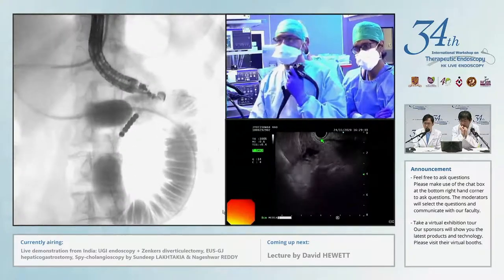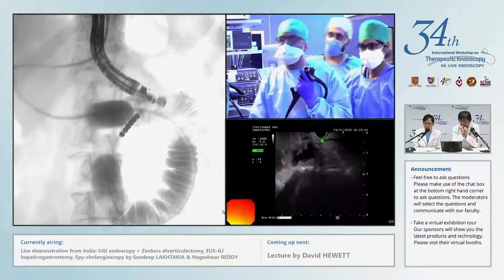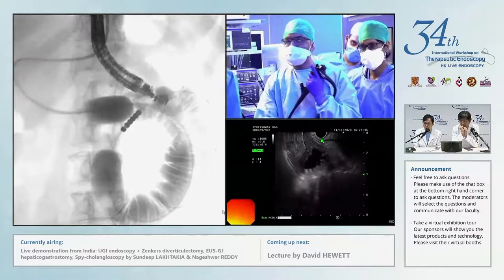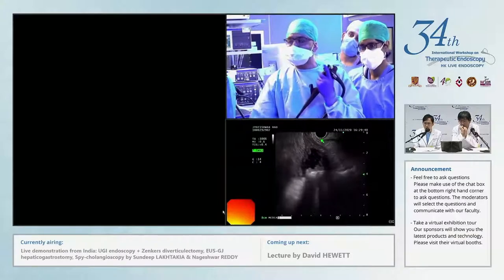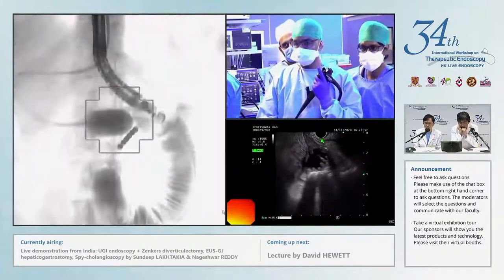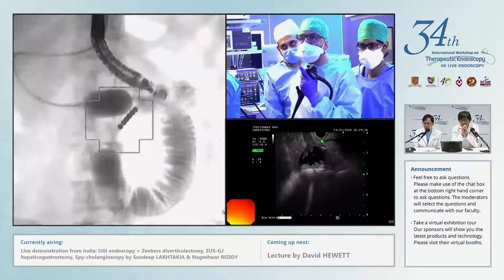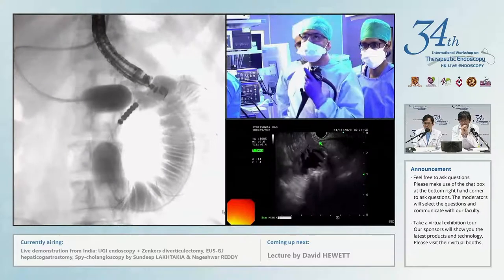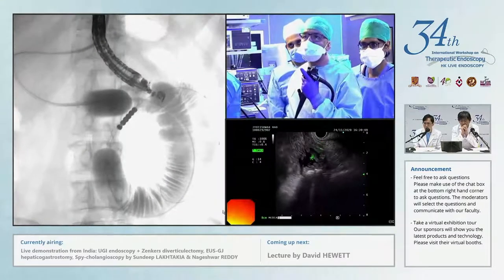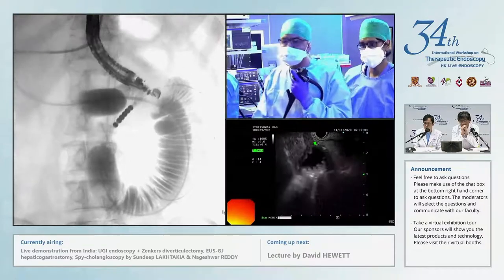Open the stent and keep it wet. How much has gone? 140? Okay, just a little more. So about 140 cc has been filled in the intervening segment. Looks nice. I think distended. Some more. Well, this is a nice area. We have a good straight length available.